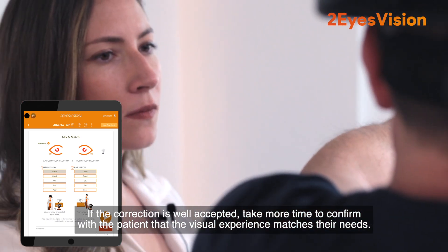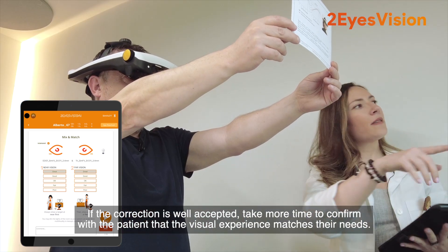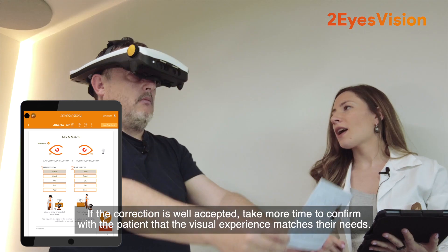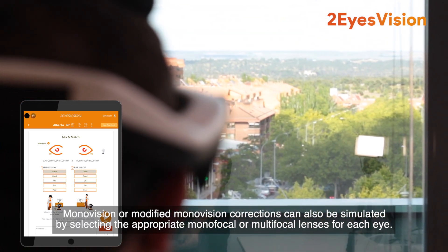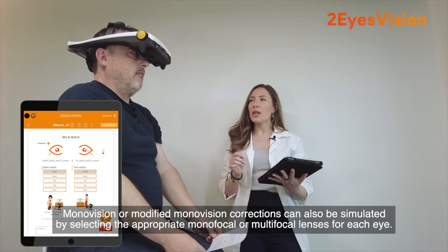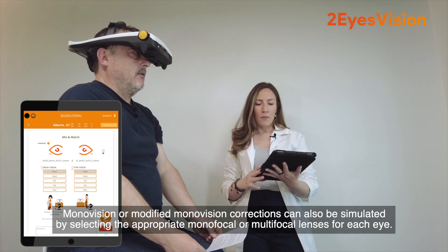If the correction is well accepted, take more time to confirm with the patient that the visual experience matches their needs. Monovision or modified monovision corrections can also be simulated by selecting the appropriate monofocal or multifocal lenses for each eye.